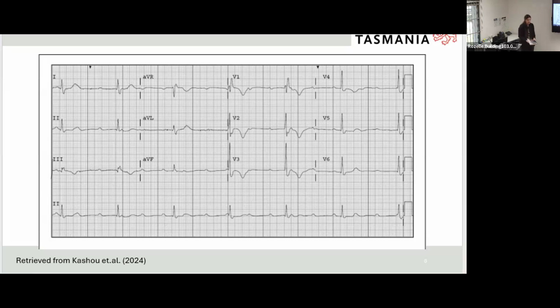Sorry, I'm going to have to go and find it after class. But yeah, the ultimate method is to just use the piece of paper and, to your point, print out an extra strip or just pull out some extra paper and then pop it down next to the ECG strip and mark the P, QRS and T wave, and then keep comparing that along the strip. That's the easy method to quickly determine if it's regular or irregular as well, if they're the same.